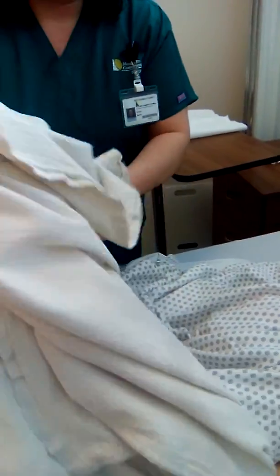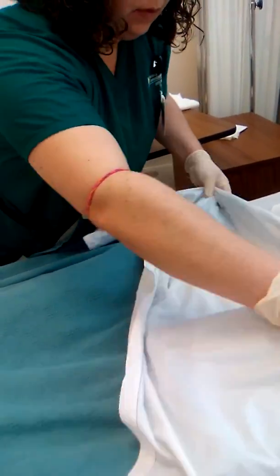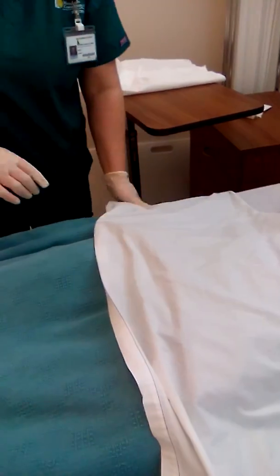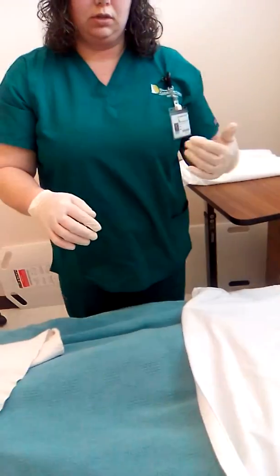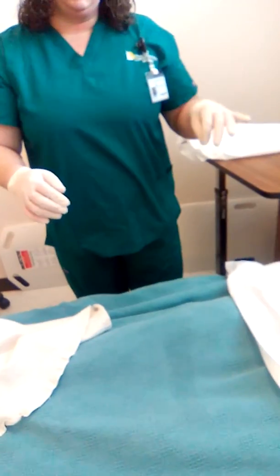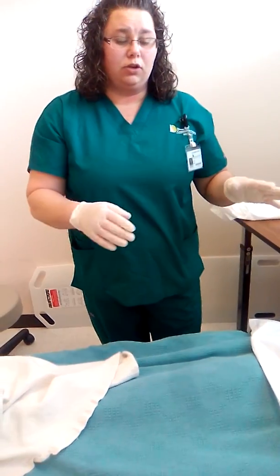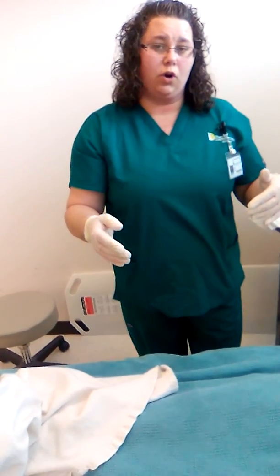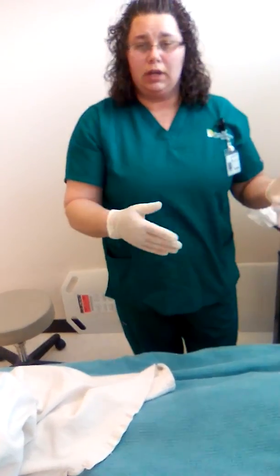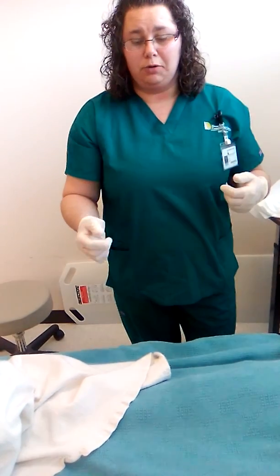I will continue to monitor the consistency, amount, and contents of the urine in the drainage bag. I will keep assessing their comfort level, and I will ensure that there are no leaks of urine in any of the tubing or the drainage system. And then I will do my documentation.